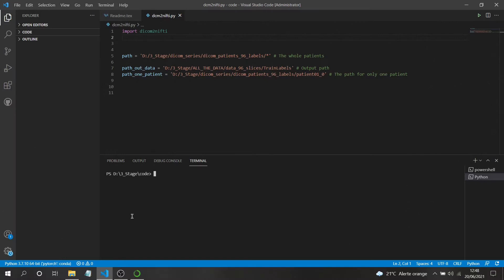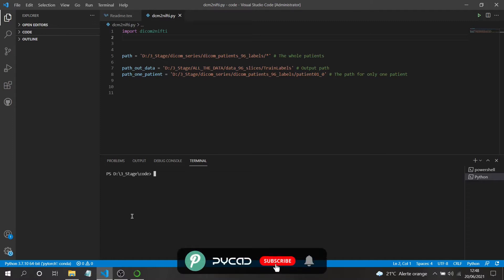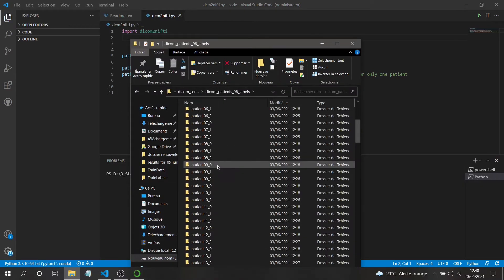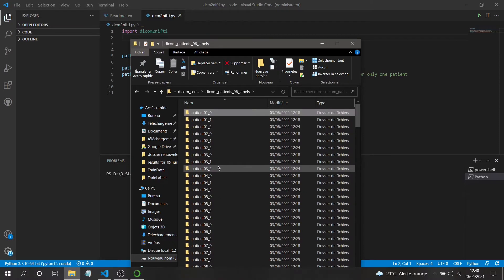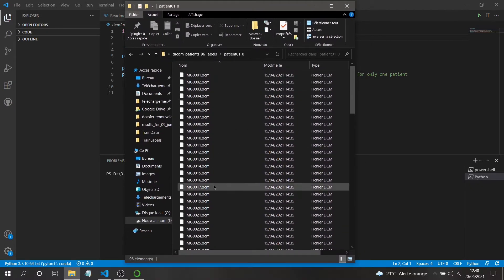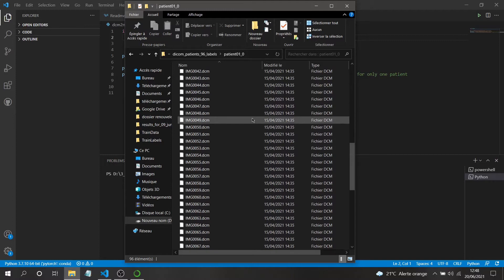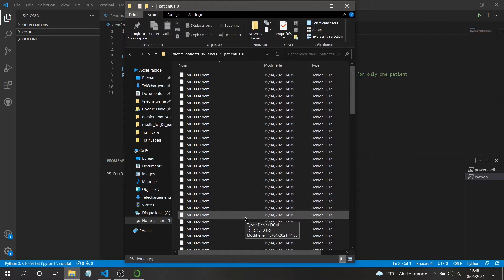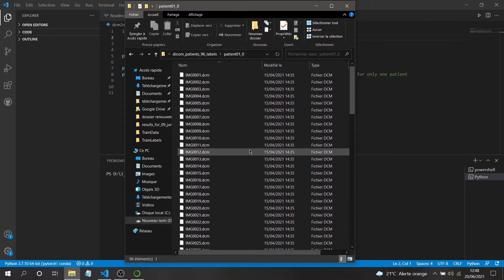Hello everyone, I hope you're doing great. In this short video I'll show you how you can convert a series or group of DICOM images into NIfTI files. As you can see, I have a set of patients, and for each patient I have some slices — in this case 96 slices per patient — and I want to convert all these DICOM series into one NIfTI file.